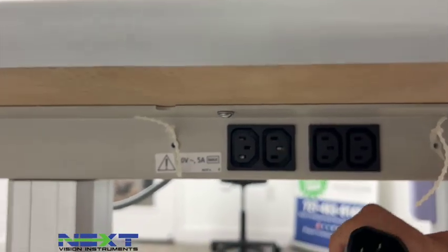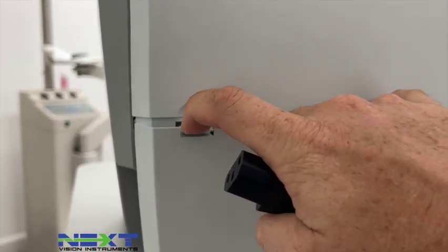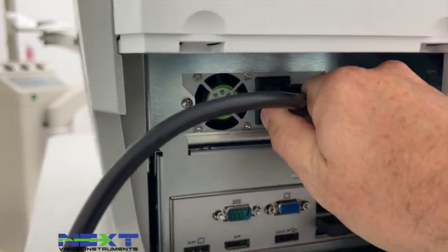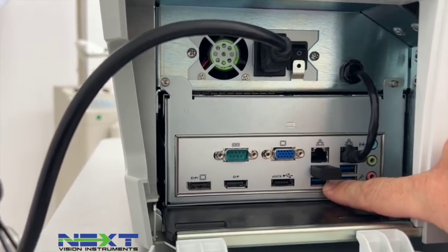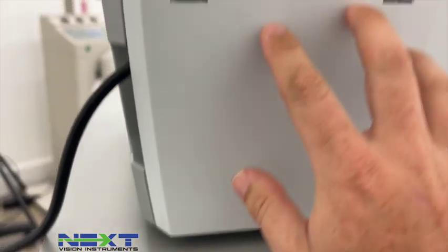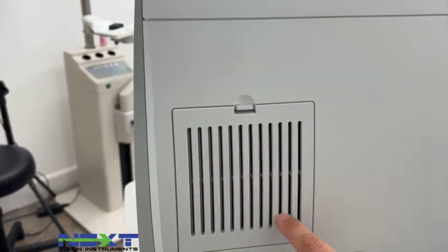Next we'll grab the black cord and come around to the back side of the unit. Under the table you'll see four connectors — this is the male end that plugs there. Over on the patient's left-hand side there's a door; pull the two tabs down and your power cord gets plugged into this port. There are also USB ports, a LAN port for networking, and a USB port where you can plug in the keyboard.